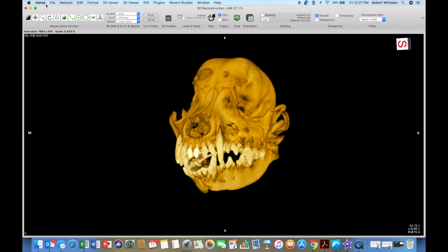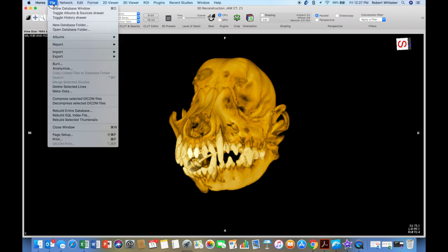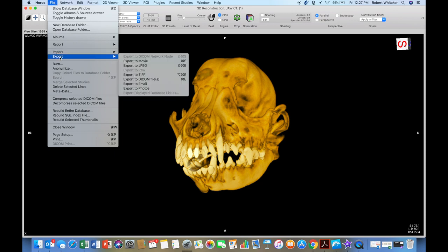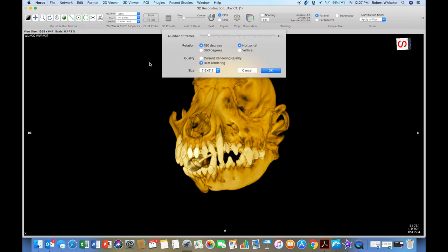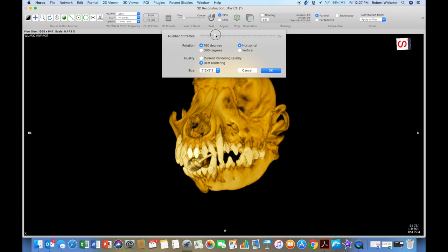So to export a movie, I'm going to go to the file tab and then go down to export and then choose export to movie. Click that. Now it's going to ask me how many frames. So I can run this up to 80 frames. I can go way high if I want to, but the more frames you place, the longer the video. So I always stick at 40 frames because that is a four second video.